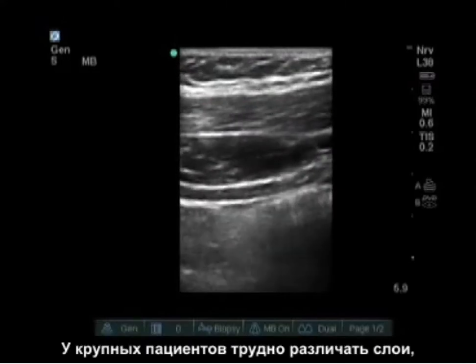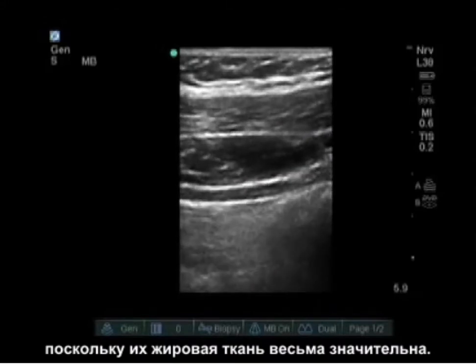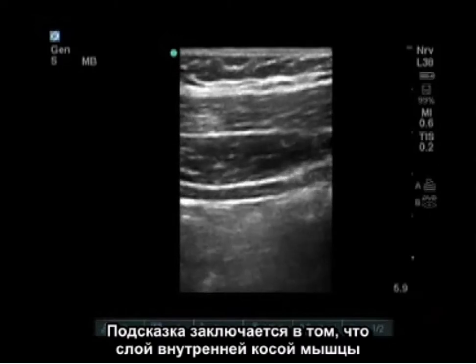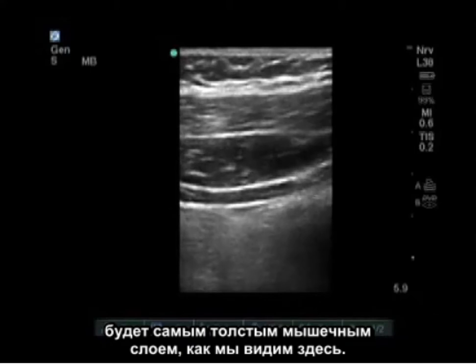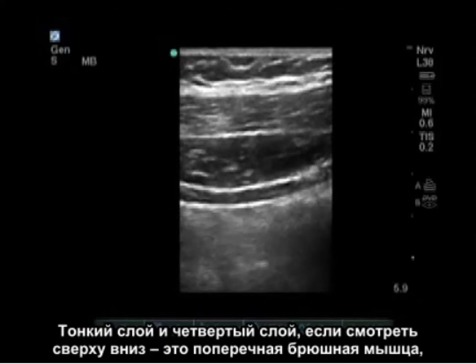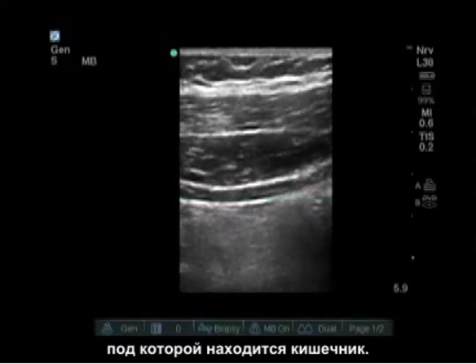Now in some large patients, it's difficult to tell layers because their adipose tissue is quite significant. A good clue is that the internal oblique muscle layer is going to be the thickest muscle layer, just as we see here. The thin fourth layer down is the transversus abdominus muscle, and below that is bowel.